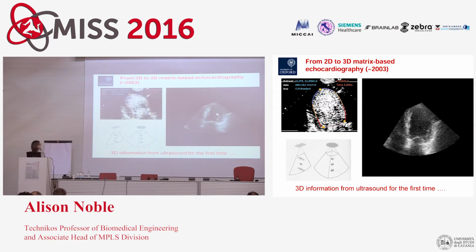Around 2000 was a very significant point in time for ultrasound. I have an example of some of the data we were using, from 2001. This was with a contrast agent injected. You inject a contrast agent that reflects ultrasound, so you get this nice white definition of the boundaries. That simplified the tracking.